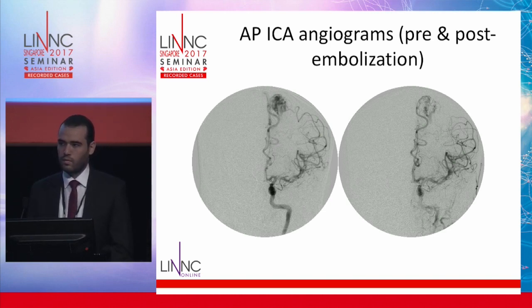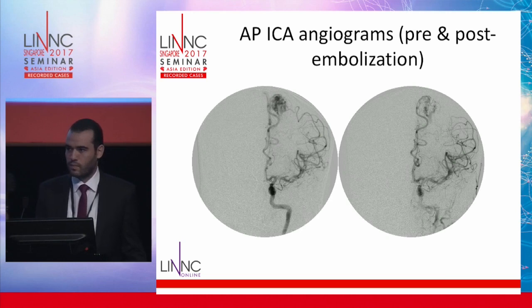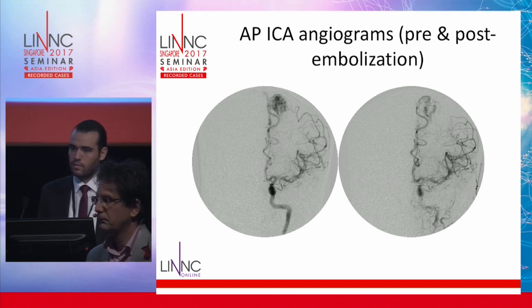And maybe he started with the idea to do a partial treatment and then to stage the procedure and then to do another session. Now, in between, after the treatment of the first session, he didn't interpret exactly the role or the interaction with the venous system. So maybe this is the reason why the patient got a bleed later on. Or maybe he was not in the condition to continue. I don't know the way it has happened.